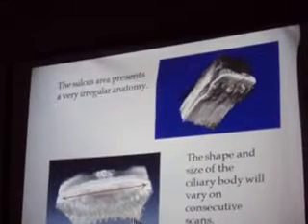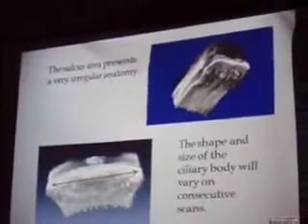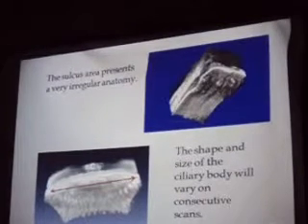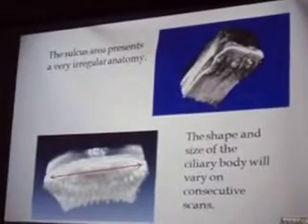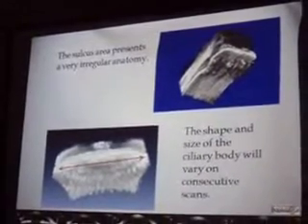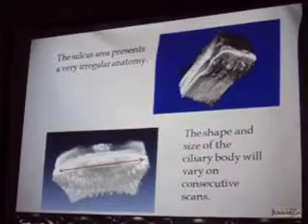And this one at the bottom is a newer one done by the ViewMax, showing you how complex an area this is that we are going to try to measure. We won't be finding a clear reference on both sides to say, hey, it's from here to here. We may need to work around that because there is not one neat and clear place where you will be placing your caliper.